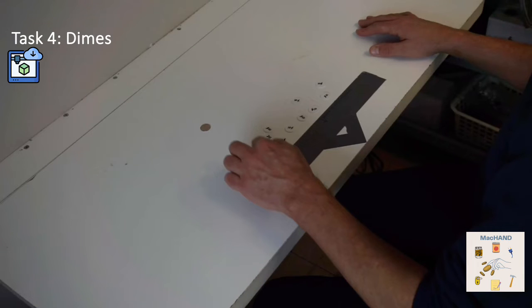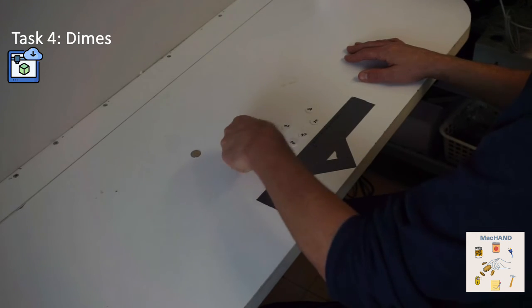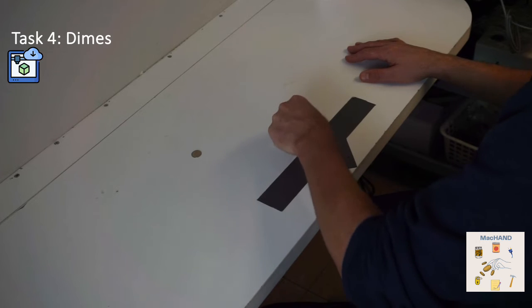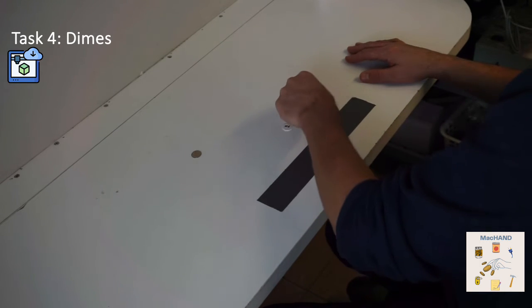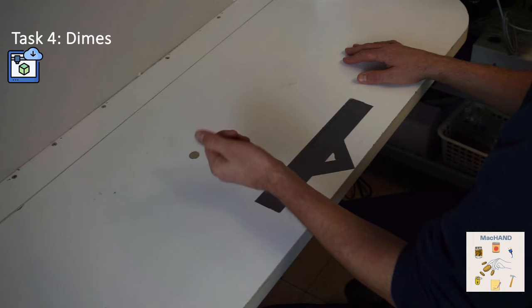This task asks the patient to pick up 10 3D printed Canadian dimes or regular dimes and then to keep them in their hand until all 10 are in their palm. The coins that are 3D printed should all be placed on the same face, on the table. The assessor's focus is on the pad pinch with dexterity and in-hand manipulation. The participant should not slide the coins off the table when picking them up.